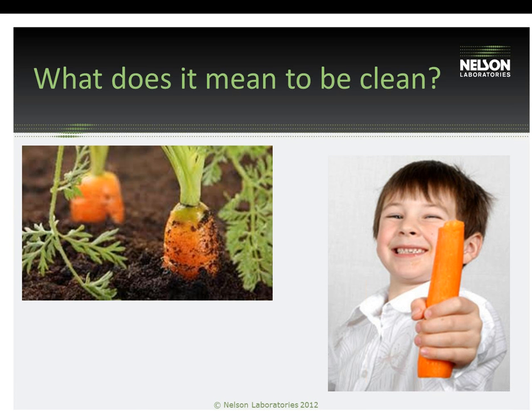To begin, what does it mean to be clean is a question that's often asked with these cleaning validations and what we're talking about today. I have a picture of a carrot up here, and you can see it's dirty, and you can see visible dirt that's left behind on this carrot. The carrot goes through a cleaning process to get it ready to consume. Along with the dirt that you can see with your visible eye, there could be contaminants left behind, such as pesticides or other chemicals that maybe you can't see.